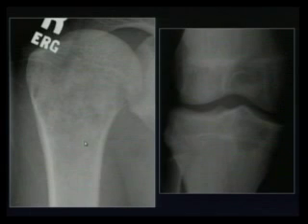Myeloma, correct. Multiple myeloma. Very good. So this is a classification of lesions with a narrow zone of transition. They call this lesion type 1. Type 1A has a sclerotic margin. Type 1B has a well-defined margin, non-sclerotic. And type 1C has an ill-defined margin, but the lesion is geographic, right?